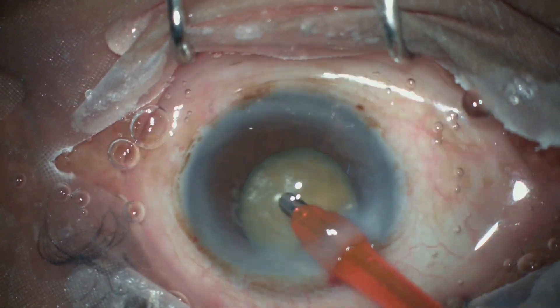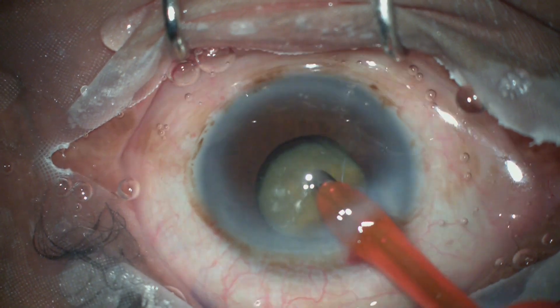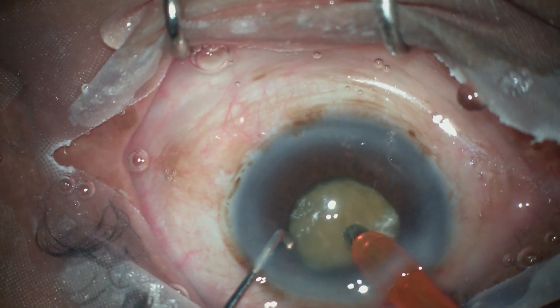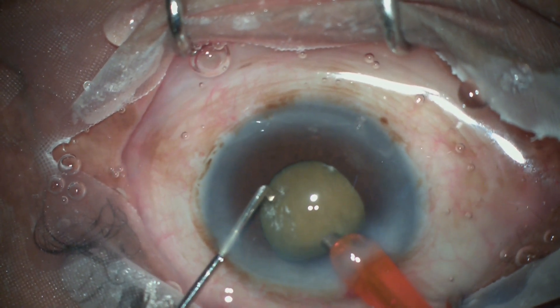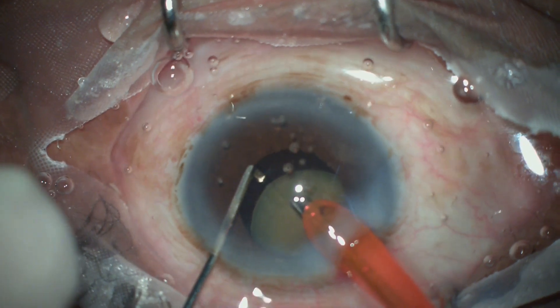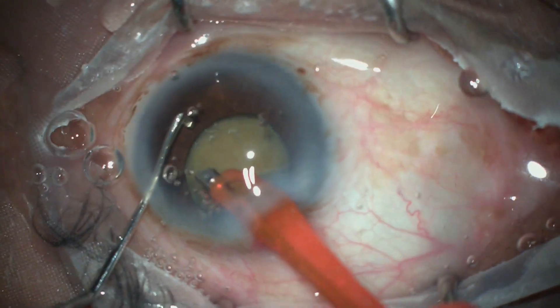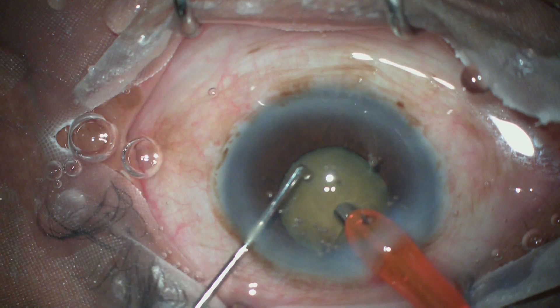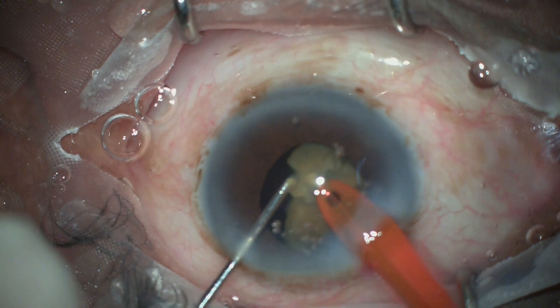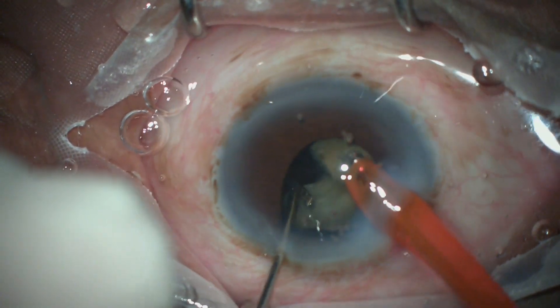Because the bag is empty, there is a lot of room for the nucleus to float around. Here we can see the difference between pulse mode phaco and micro-pulse mode phaco. When phaco power is applied, the nucleus is simply repelled away from the phaco tip, making it difficult to hold the nucleus at the desired place. Wherever I wanted to bury the phaco tip, the nucleus vibrated and turned away — especially problematic at the periphery where the nucleus is also tilted.